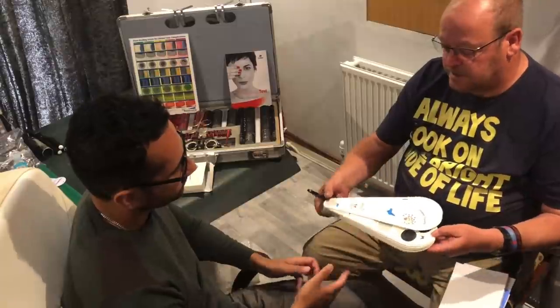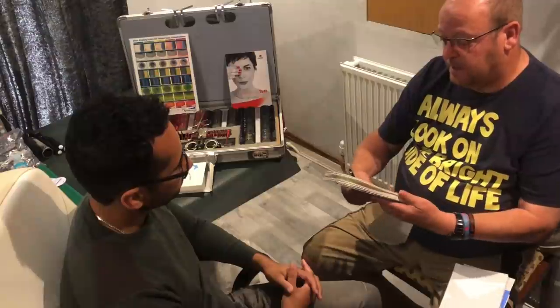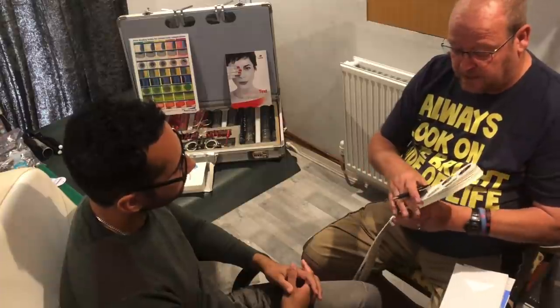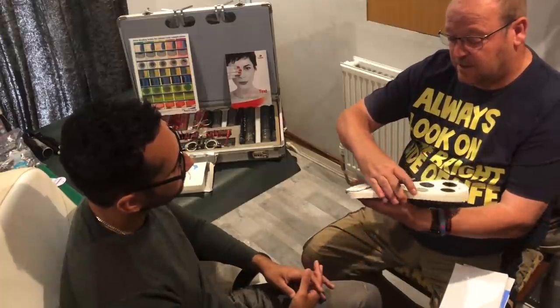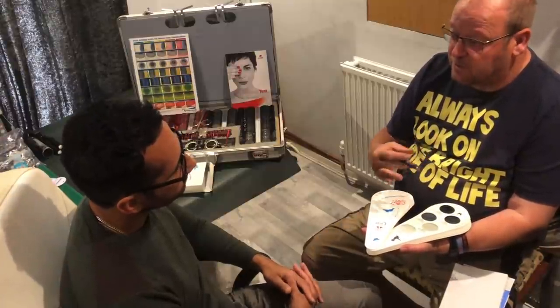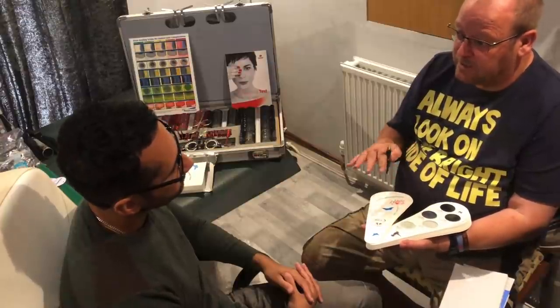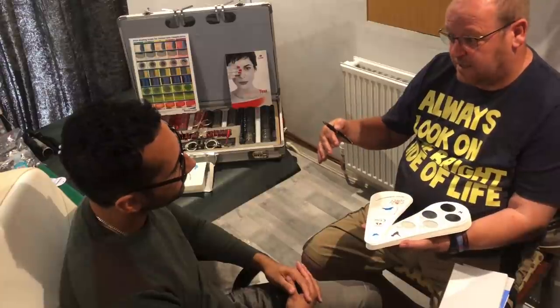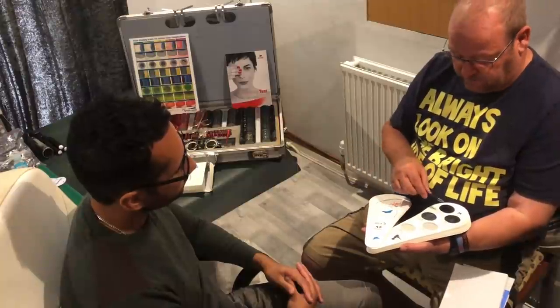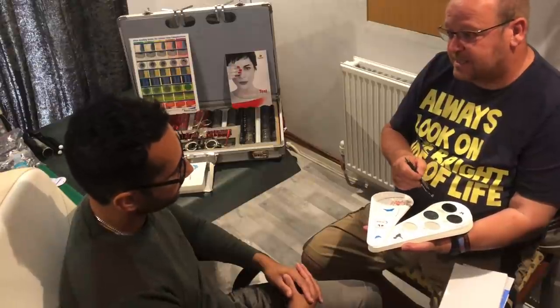Now we'll go on to some other colours. If you wanted a lens that looks darker visually, then we go on to the grey. Now with the grey lens, the optical effect is that the light itself is taken away more so. When it comes to the brown, that seems to take away more glare but gives you some of the light that was glaring you before. With grey, this actually makes things look darker, but colours stay exactly the same.